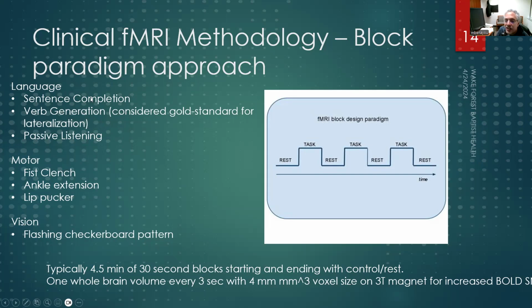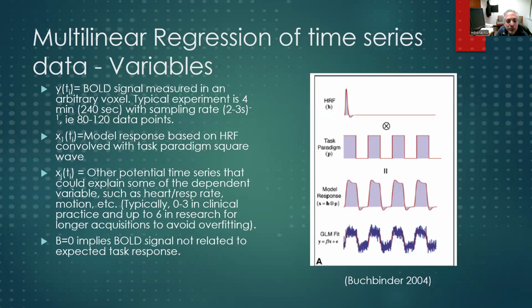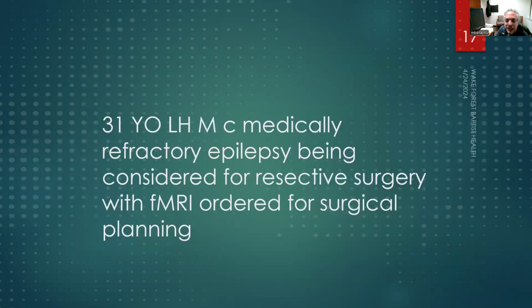And so if the gold standard is finding Wernicke's and Broca's, you're probably going to do that better with something phonologic, actually, than you will with something semantic. That's probably the reason we see more of it with Broca's and Wernicke's specifically correlating with where they find it on gold standard intraoperative mapping. But there's been some questions lately about whether we're looking at the right thing, and maybe the semantic areas are also important. So it's a bit contentious, but that's why I put that there. It was relative to the gold standard of intraoperative mapping for Wernicke's and Broca's.